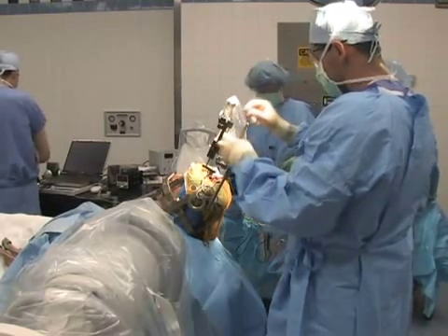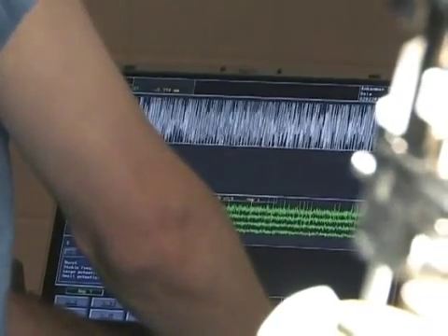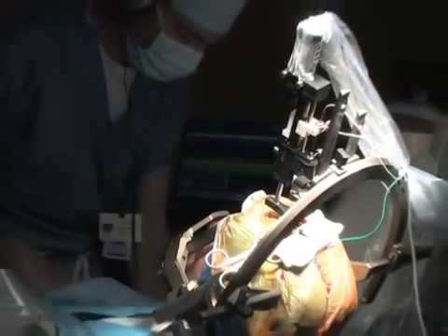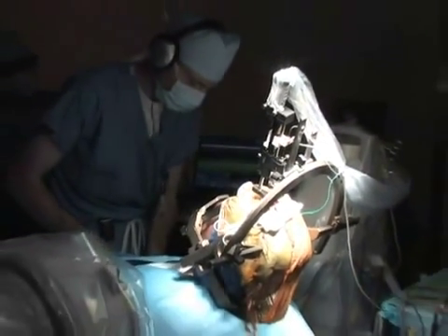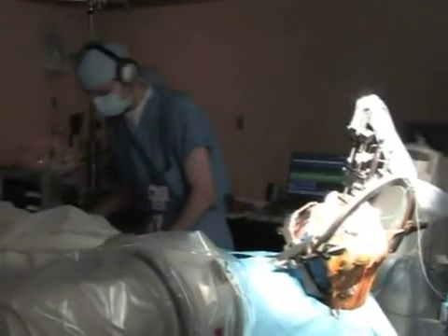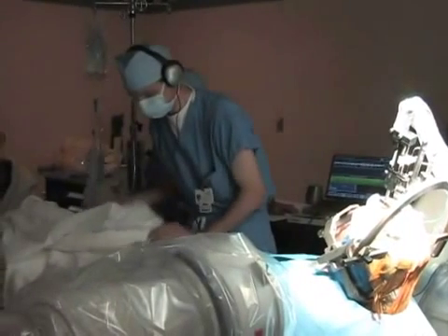The recording electrode detects the brain cells firing and displays the waveforms on a computer. The surgical team will listen for the correct nerve cells while moving your arms and legs. This is the most time-consuming part of the procedure, and it must be repeated for both the left and right sides of the brain.